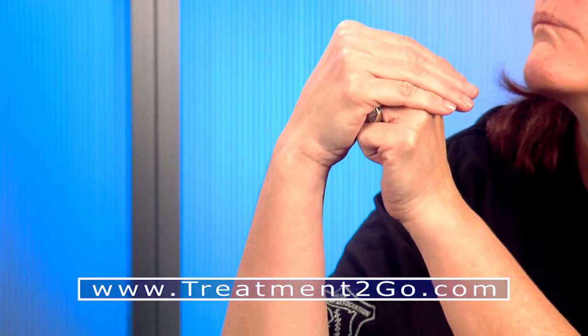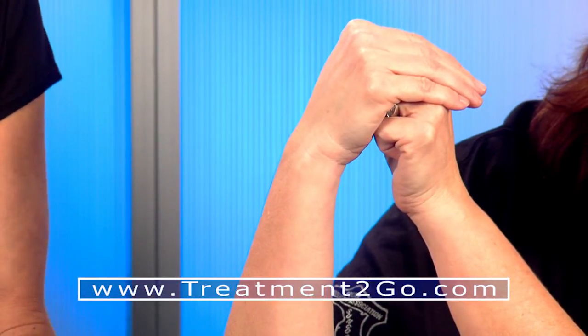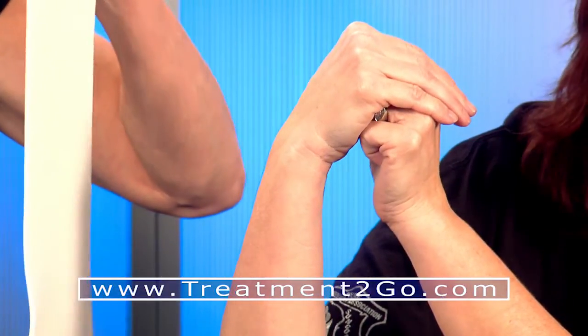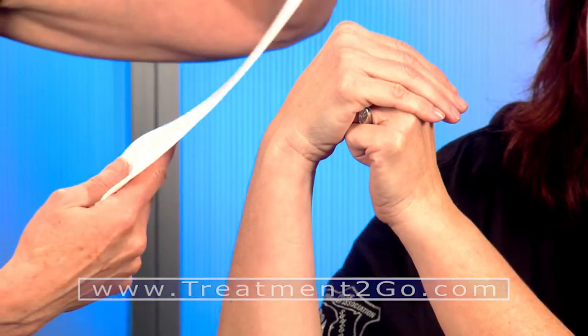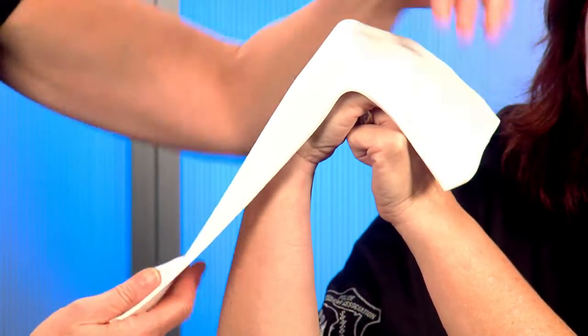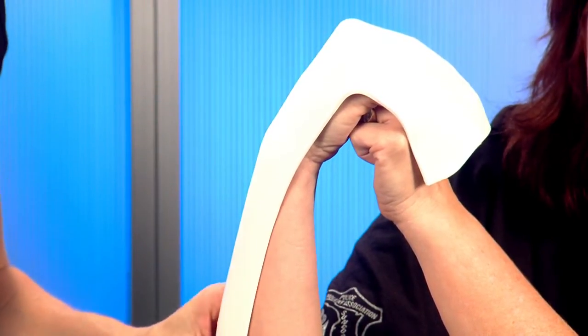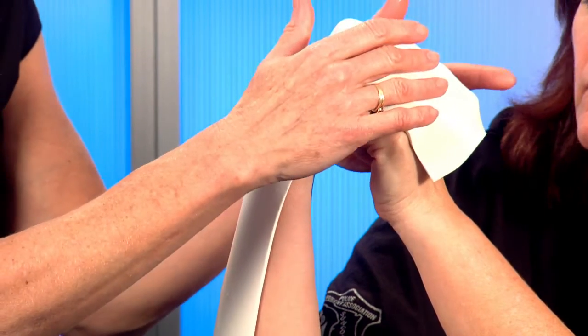I'm going to take my material out of the splint pan. I am using a material called Soft Fit, 1/8 inch thick, which is highly conforming and drapey. And I'm just going to stretch it over the knuckles and pull it down the forearm so you can see how well it conforms to the hand.